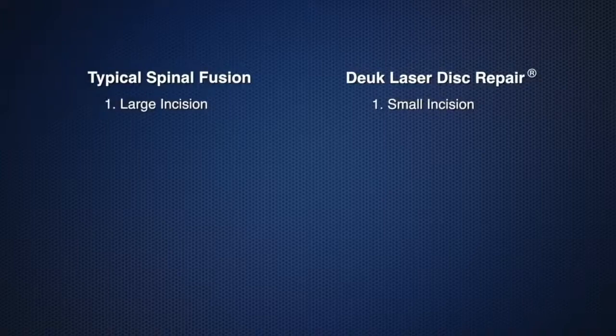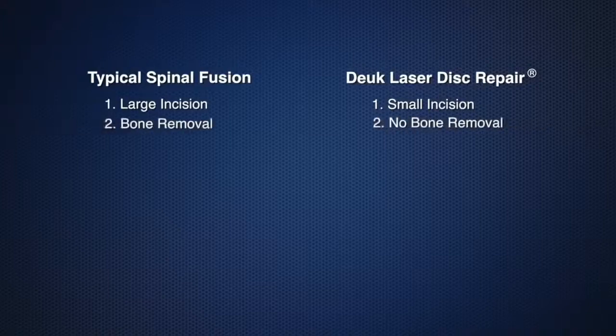The Deuk laser disc repair's 1/2-inch incision leaves no scar tissue around the spine or nerves. A large amount of bone is removed with a spinal fusion. With the Deuk laser disc repair, no bone is removed.